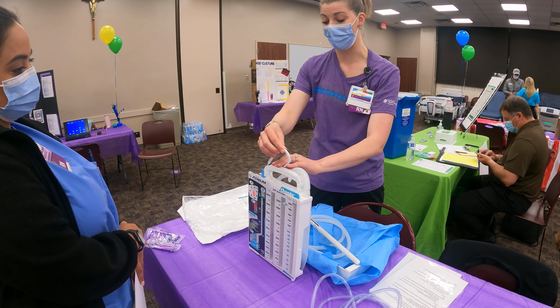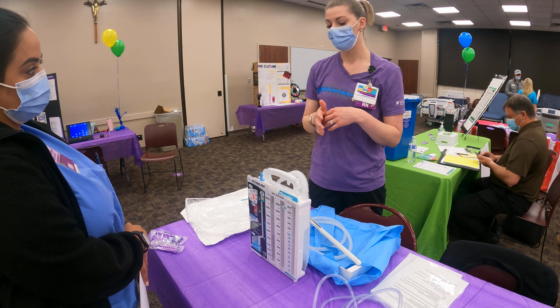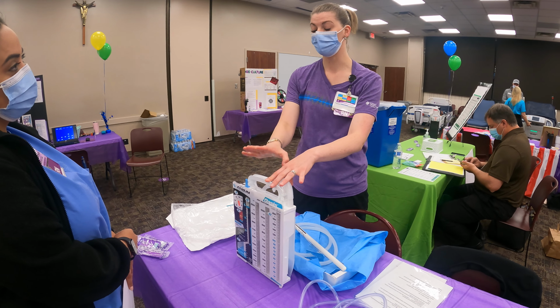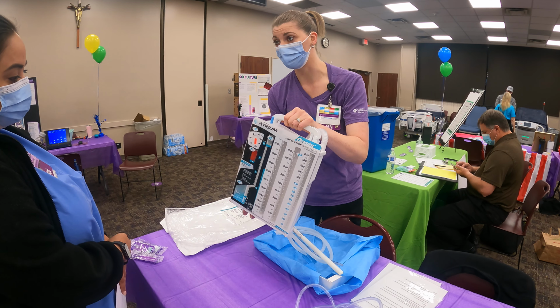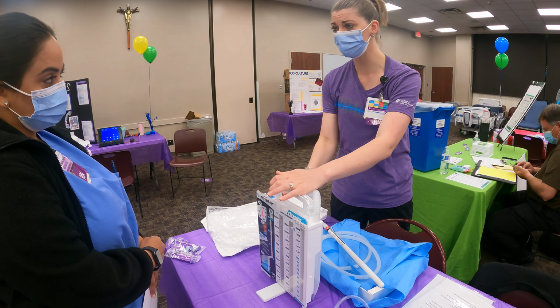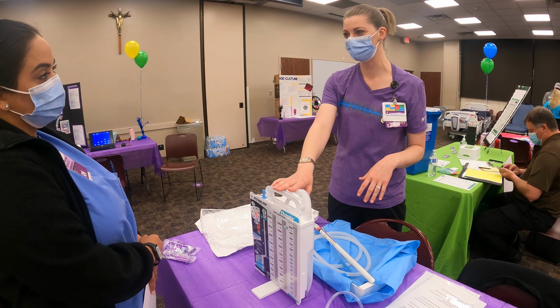When the patient gets back to the ICU or the floor, wherever they're going, this will not drain unless it's below the level of the chest. So chest tubes need to be on the floor, okay? If they're on the floor, sometimes they can be a little unsteady. They have a stand that they sit on that prevents it from being knocked over. Things do happen, and they get knocked over all the time, right?